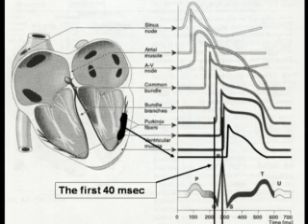So what's going to happen now is, and this is something that always used to confuse me, taking the monophasic action potential and making it into a QRS on the surface ECG. What happens is that signal, hey guys, let's depolarize, spreads through the heart. We're going to have a net potential difference in our electrical forces in different regions of the heart. As that spreads through, that's where we get our QRS.